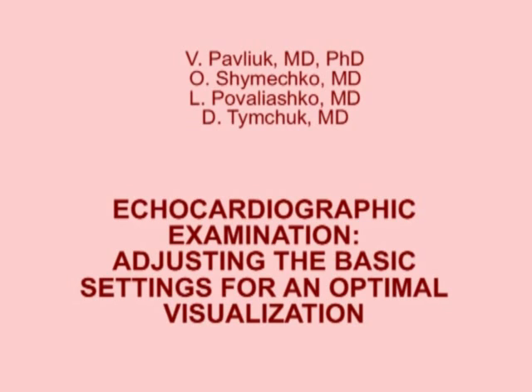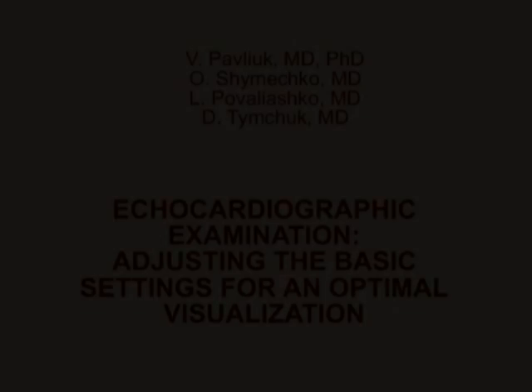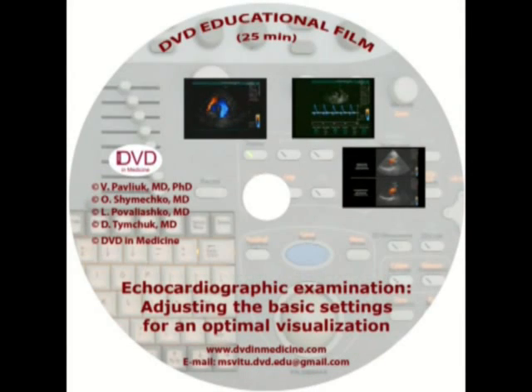Echocardiographic examination, adjusting the basic settings for an optimal visualization. In addition to the basic choice of transducer type and frequency for the echocardiographic examination in hand, there are many other settings on an ultrasound system which need to be adjusted.